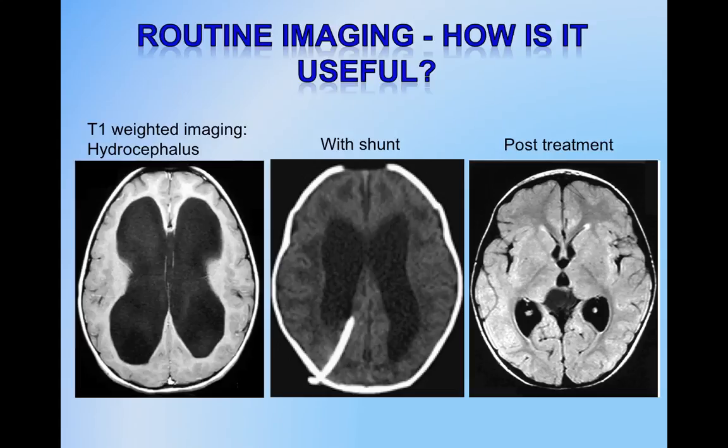So a few weeks ago there was a kiddie who was going to open a chest of drawers and pulled the drawers a little bit too hard. There was a big TV on top of it and the TV landed on top of him. So this isn't this particular case, but this is an example. When that happens, often there's swelling, they get this water on the brain. You can see here ventricles, which are normally much, much smaller, enlarge, and you're in danger of squashing some major artery and causing an ischemic event.